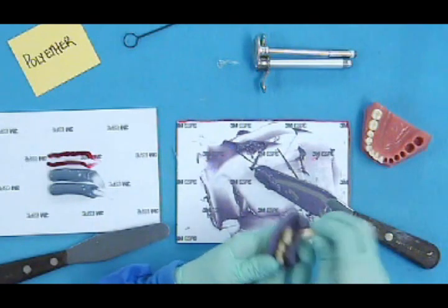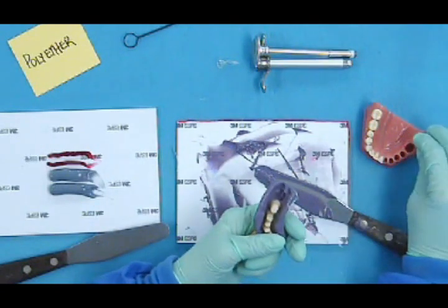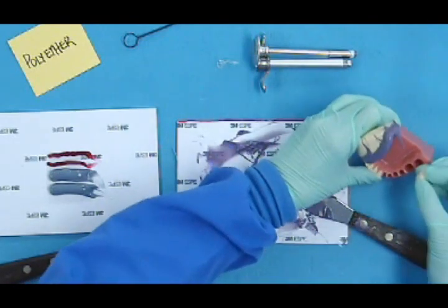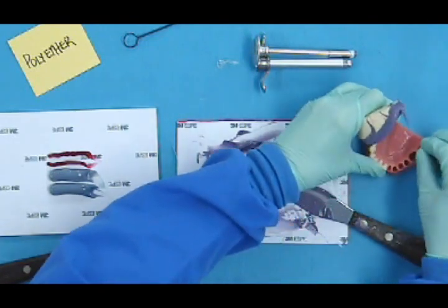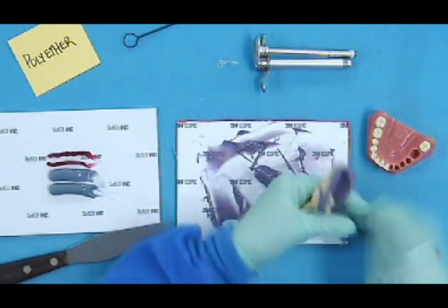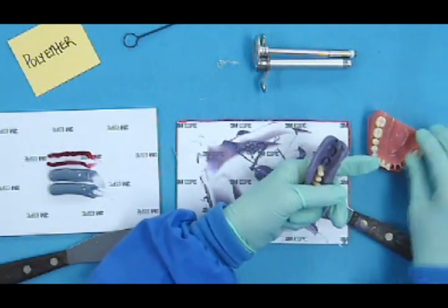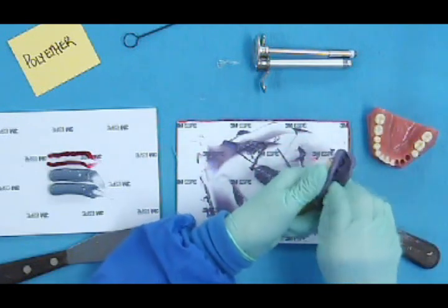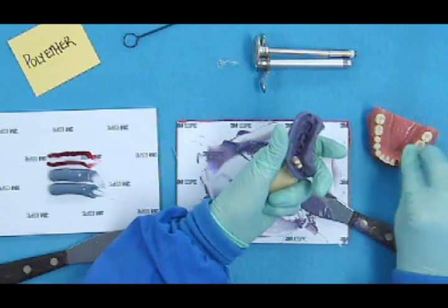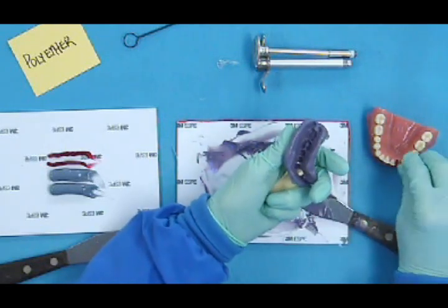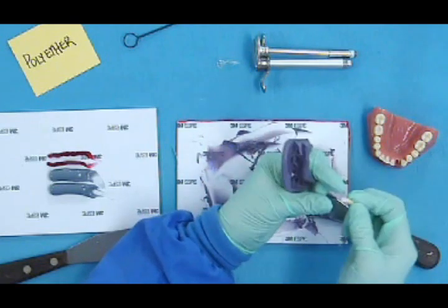This would not, should not happen with your patient, heaven forbid. So we would put these back into our dental form. So we would take a little bit of time. The prep took out the whole quadrant.